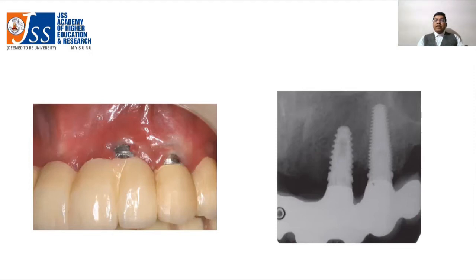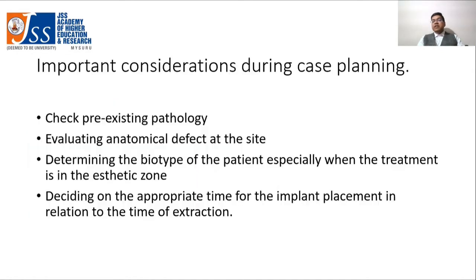Had it been properly planned, the bone augmentation during the surgery could have been done for better results. If the soft tissues are not handled properly, or if correct assessment of the soft tissues is not done, it can lead to peri-implantitis or peri-implant mucositis. In order to prevent these complications, the soft tissue has to be handled carefully.